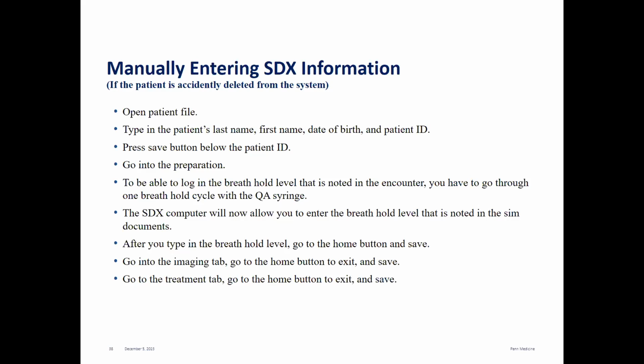You can enter the patient's final level that you got by adding all 3 together, dividing by 3, and then multiplying it by 0.85 or 0.75, whatever percentage you set. For breasts, we do 0.85. For everything else, it's 0.75, so 75%. That is noted in the documents.